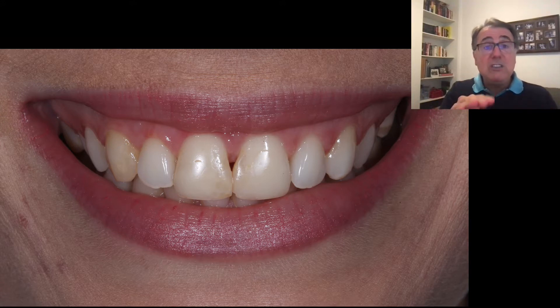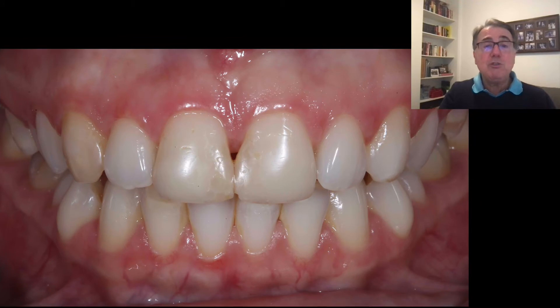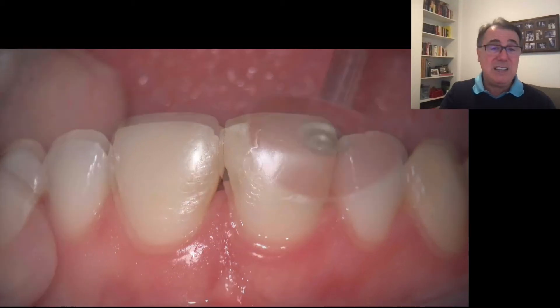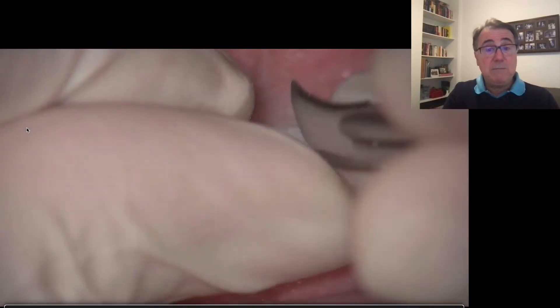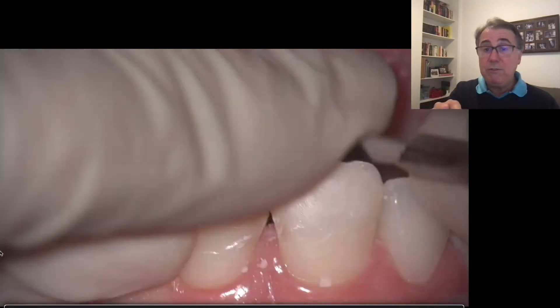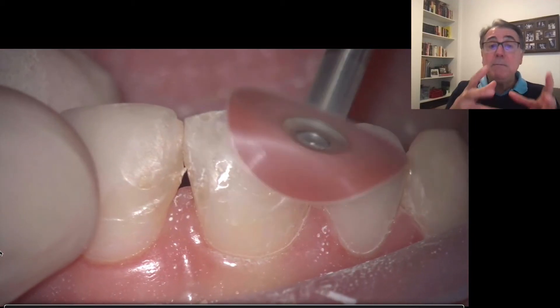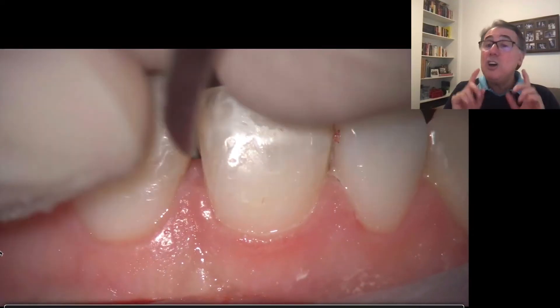This diastema closure is also going to be extended to a full veneer. So this is the case again from the side view, and now with the lips retracted. The first thing we're going to do is remove the old composite. This is not an easy task. Of course, we can use discs, bars, a scalpel number 12 blade — everything that helps removing the composite but preserving as much of the sound tooth structure of the patient as possible.